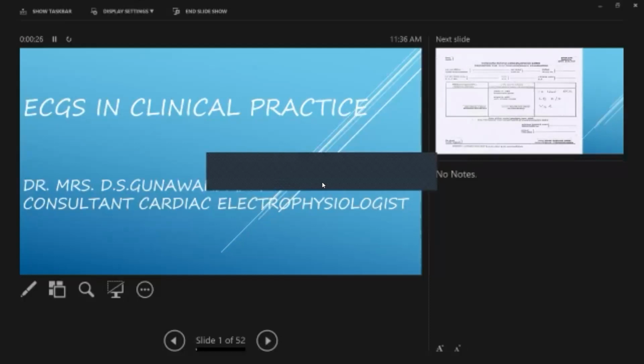The topic I am going to discuss today is ECGs in clinical practice. As you all know, ECG is a very common investigation. We do make requests during our day-to-day clinical practice. ECGs are useful to diagnose and manage cardiac emergencies, for the preoperative management of patients, as well as diagnosis, management, and follow-up of almost all cardiac ailments.